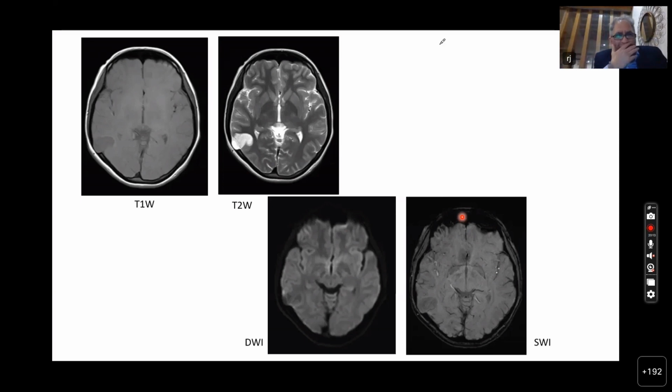Yes, and I would also like to add that if the patient is presenting just after an ictus and there is edema, we can also expect to see post-ictal changes in diffusion weighted imaging, which we'll see as diffusion restriction along that particular cortex.